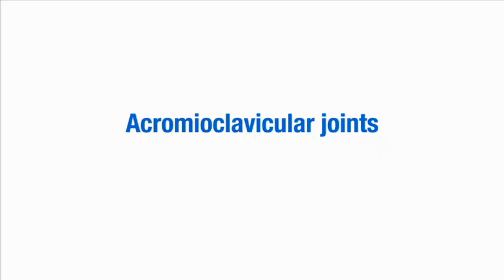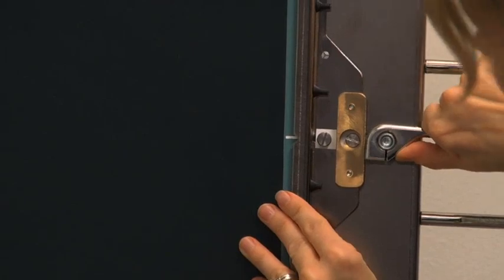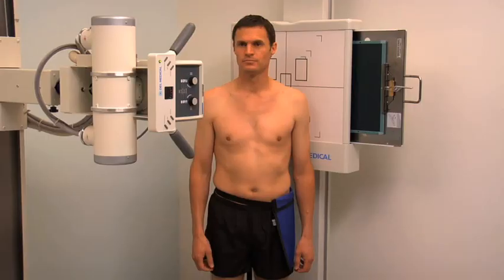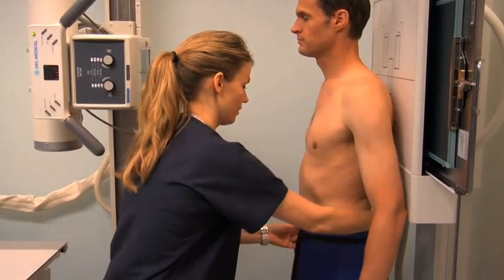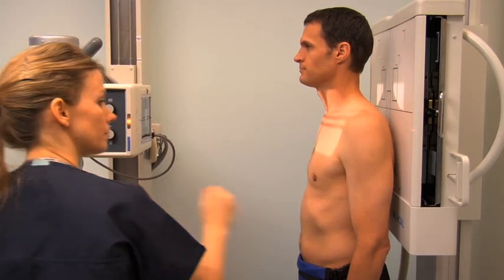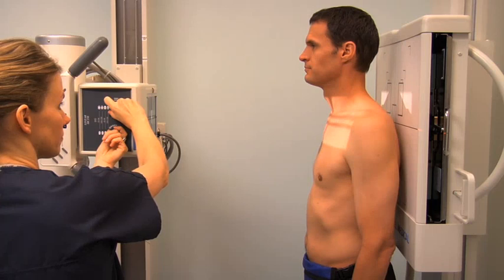To obtain a radiograph of the acromioclavicular (AC) joints, begin by selecting a 14-by-17-inch cassette oriented crosswise in the upright bucky. Both AC joints are imaged together for comparison. Set the SID to 72 inches. Set the exposure factors to between 60 and 70 kV and 12 and 16 MAS. Select the small focal spot and the upright bucky. Ask the patient to stand against the upright bucky facing forwards with the posterior aspect of their shoulders in contact with the upright bucky. Position the lead shield over the patient's reproductive organs. Check that the mid-sagittal plane is at the center of the image receptor and that the image receptor is at the level of the AC joints. Ask the patient to relax their arms by their side and center the central ray to the mid-sagittal plane at the level of the AC joints.